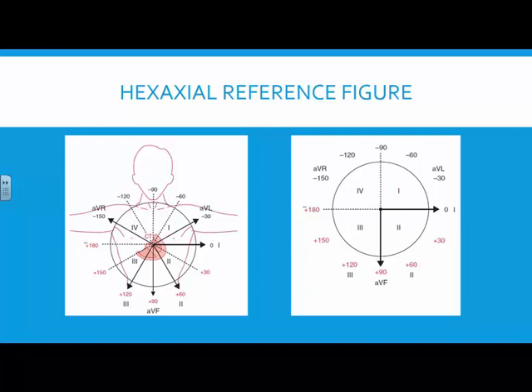So what happens is, we understand Einthoven's triangle pretty good, right? Physically, it's still 3 dots, but we're only using 2 dots. In lead 2, that one's negative and that one's positive. Lead 1, that one's negative and that one's positive. Lead 3, that one's negative, that one's positive.